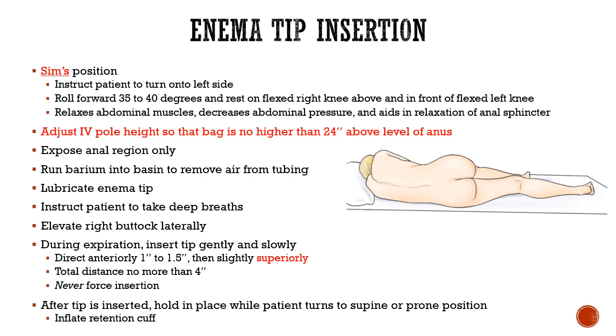For enema tip insertion, we're going to use the Sims position. Then we're going to instruct the patient to turn on their left side.